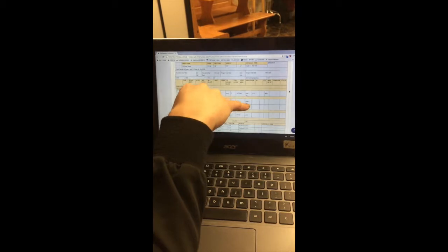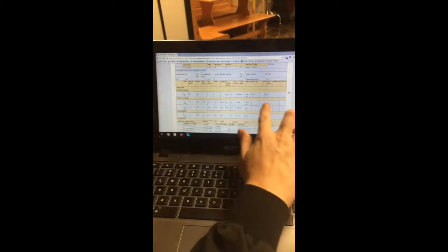And then her mucous membrane color. We have her hooked up to... These last ones, we didn't have her hooked up to that machine that tells us those numbers in surgery. So we have all those. We have before surgery, during surgery, and end surgery.